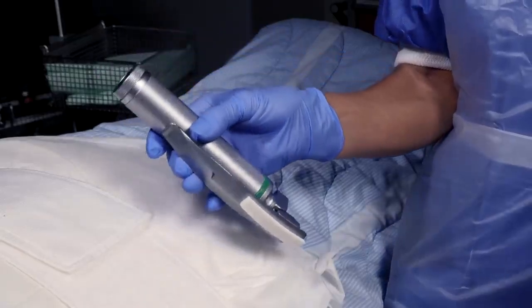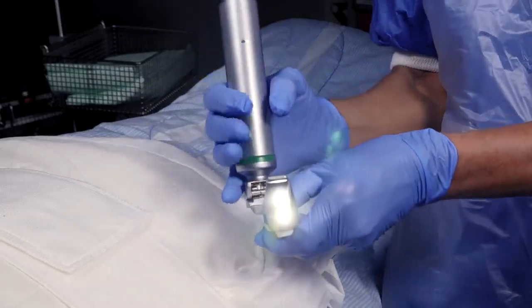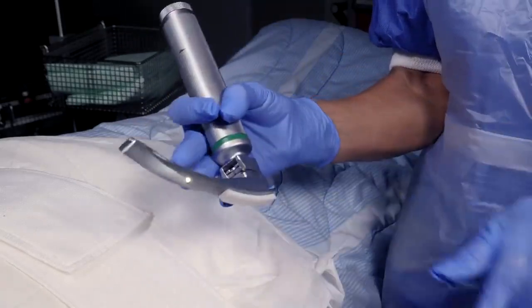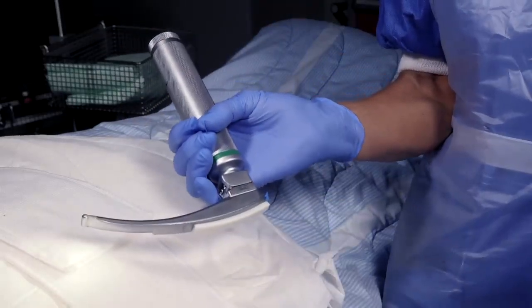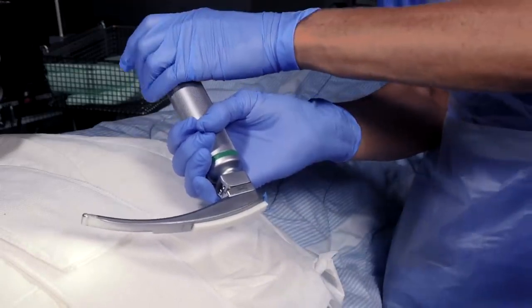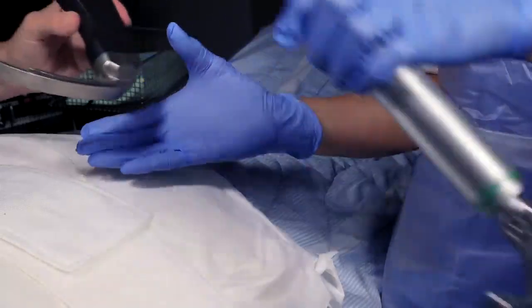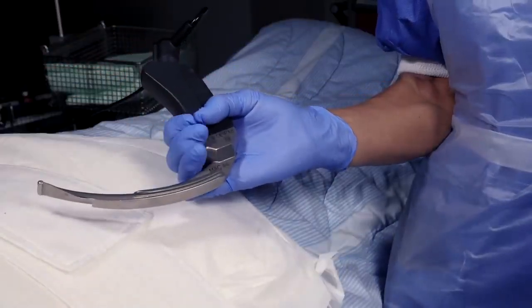This requires a laryngoscope. We will teach the traditional direct laryngoscopy, but for filming purposes we use a video laryngoscope that has the same shape.